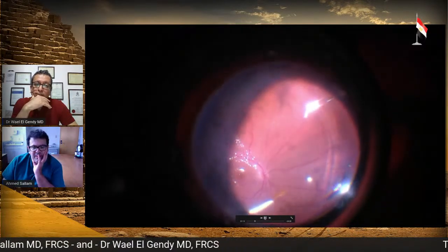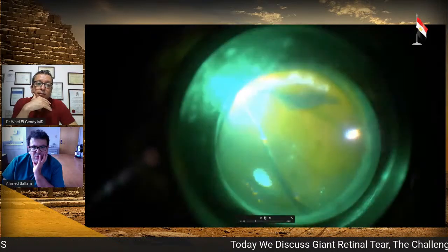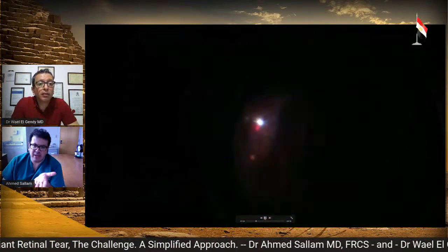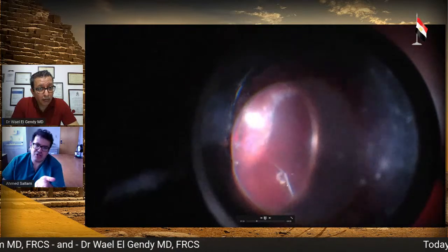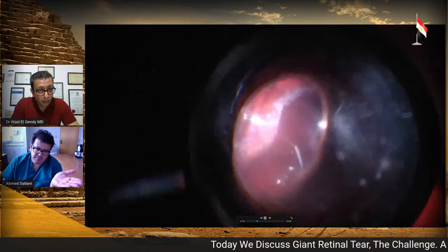So here we injected the PFCL, then laser a few rows. I usually do about 2 to 3 rows. And then I would indent and use illuminated light. Few thoughts here. First, to avoid the sloshing, you can actually complete this step under air if you're going to go into gas or oil, right?